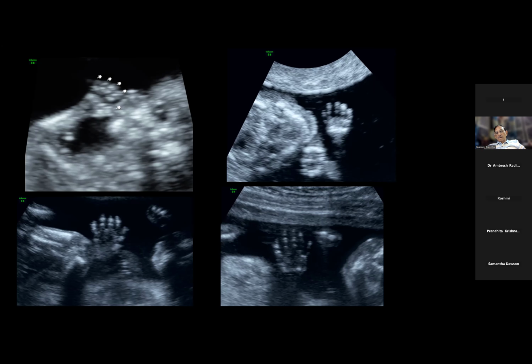In a case of Bardet-Biedl syndrome, when we see echogenic kidneys, we have to confirm it by looking at the toes and fingers. Similarly, in Ellis-van Creveld syndrome, when we see a cardiac anomaly, we'll have to look at the upper limb for extra digits. Actually, it goes both ways. Sometimes we might find clues in the fingers and toes first, and then look for the other thing. It may go the other way also.